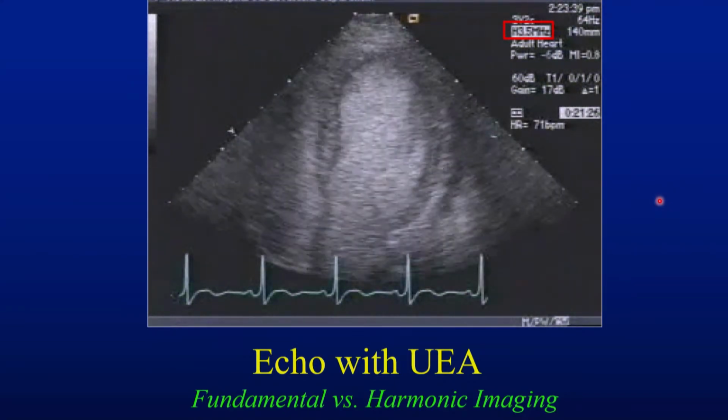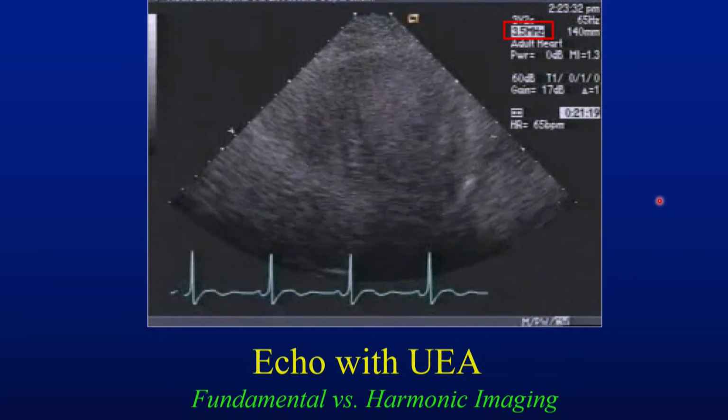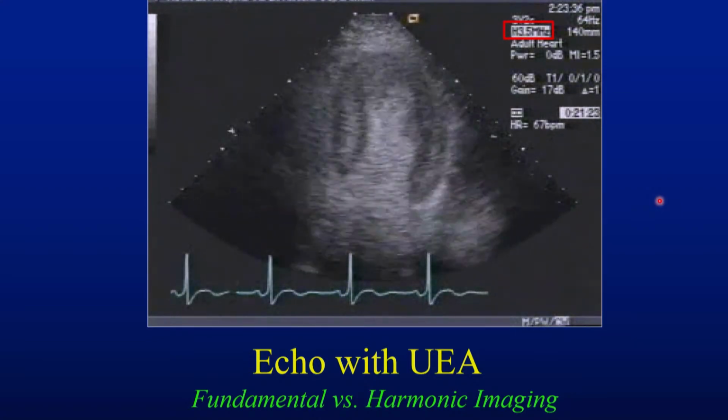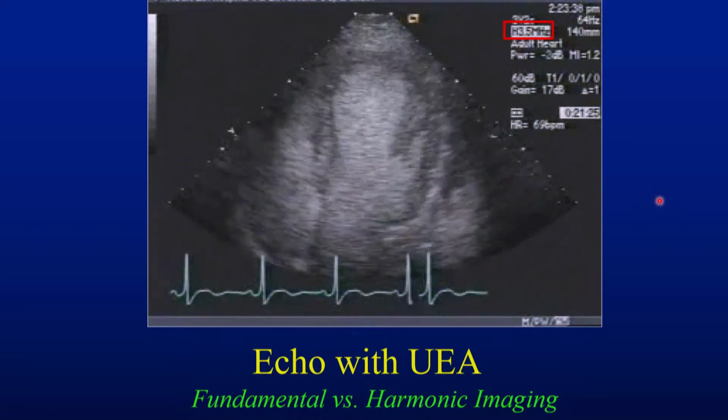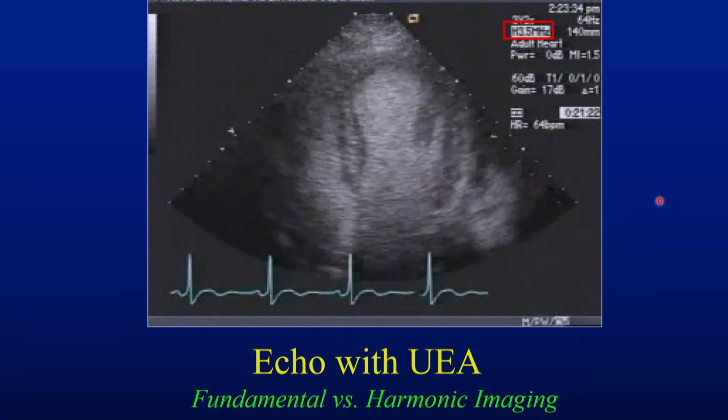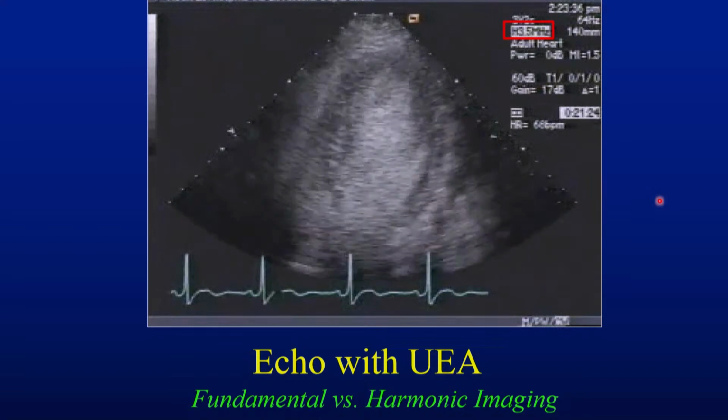And you want to decrease the MI, so decrease MI so I can have a decent image. And you had a blip of fundamental. Watch, decrease MI, up, fundamental. That blackness, that basically uniformity.